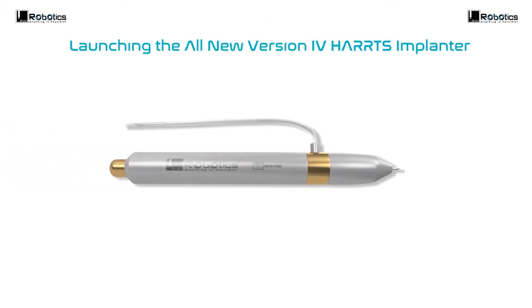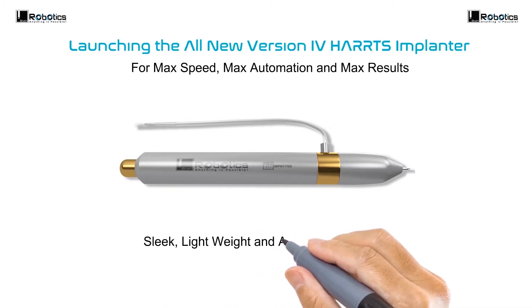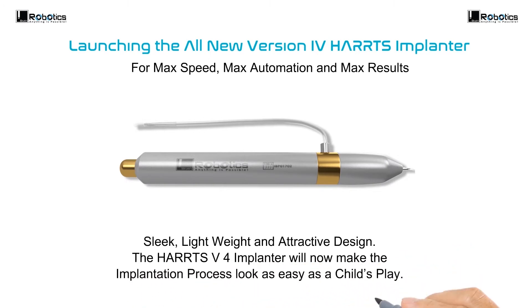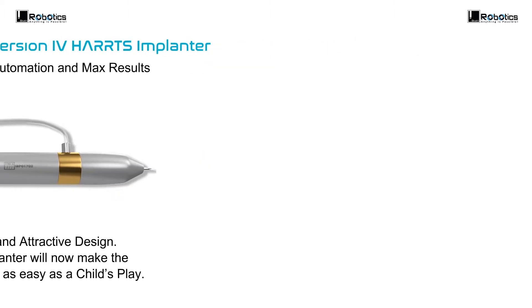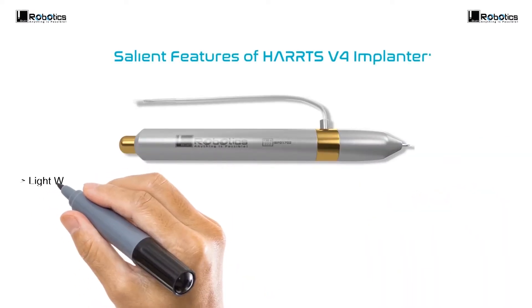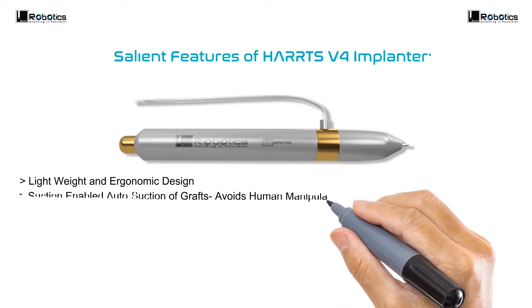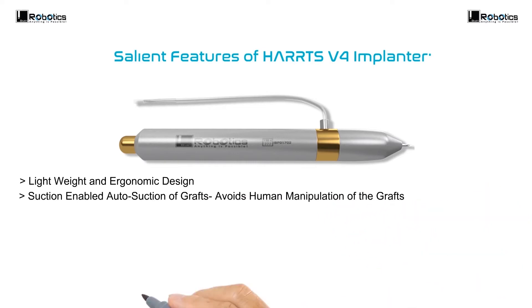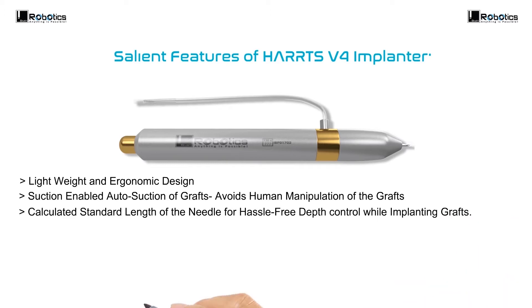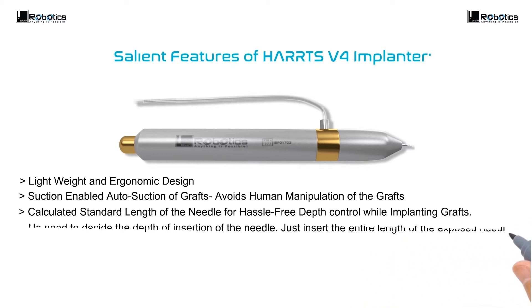Automation and maximum results. Sleek, lightweight and attractive — the HARRTS Version 4 Implanter will now make the implantation process look as easy as child's play. Salient features: lightweight and ergonomic design, suction-enabled auto suction of grafts, avoids human manipulation of the grafts while engaging and implantation. Calculated standard length of the needle ensures hassle-free depth control while implanting grafts — no need to decide the depth of insertion of the needle; just insert the entire length of the exposed needle to get the standard outcome.